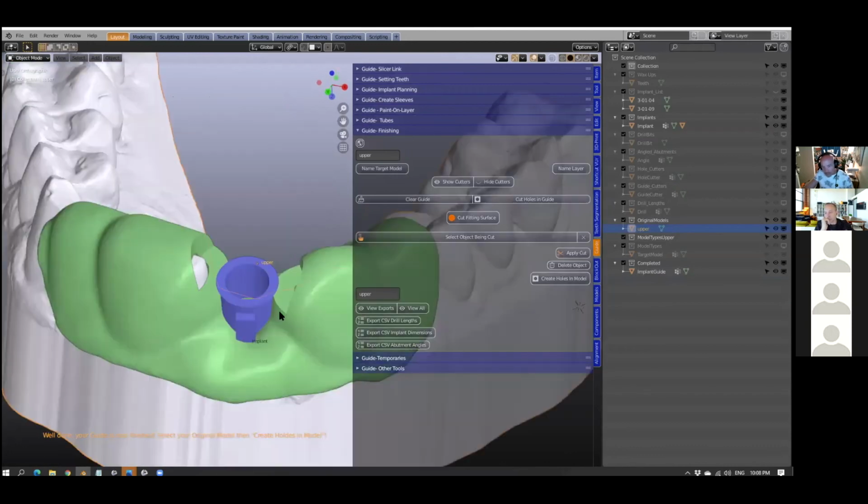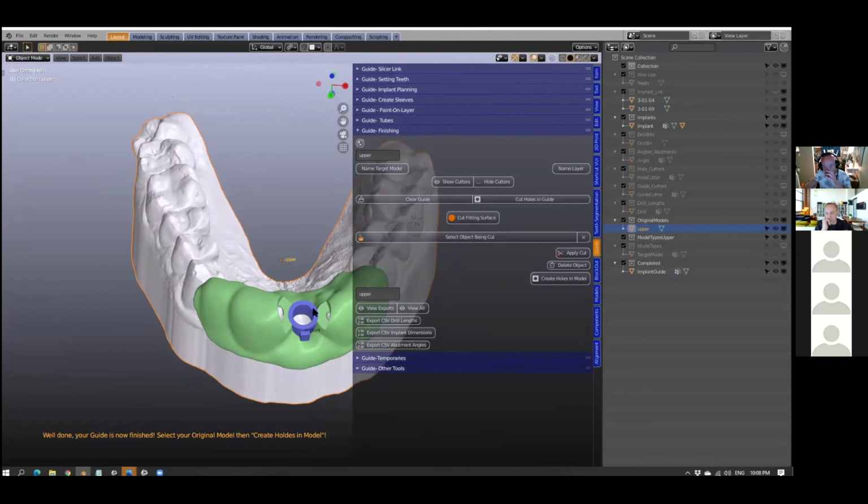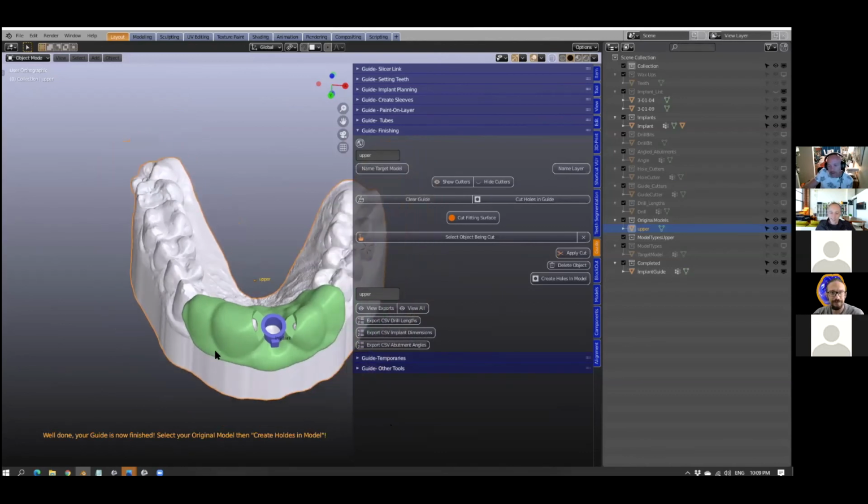Okay, so are there any questions about the paint on? I'll just quickly make it. Are we out of time? Do we still have a bit of time, Wolfgang? Yeah, it's 8 minutes past, well, we're at 10 o'clock at night, so 8 minutes past the hour. I don't know if you want to make the skeleton guide. I can't see anyone. Do people want to partake and see? Maybe you can give us a fingers up on the reaction. Okay, we've got one.